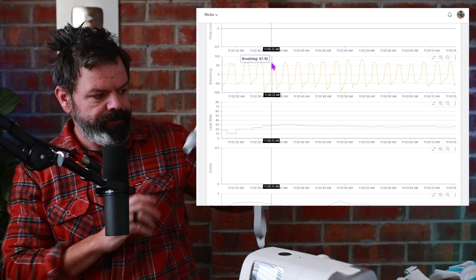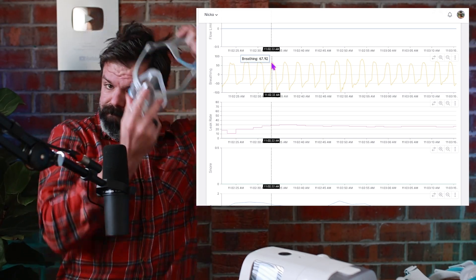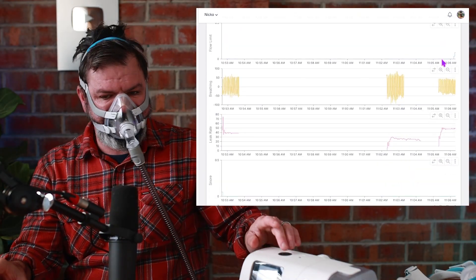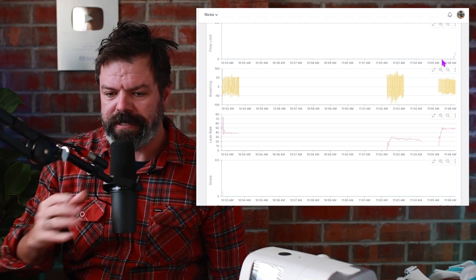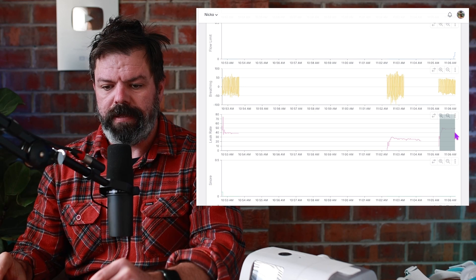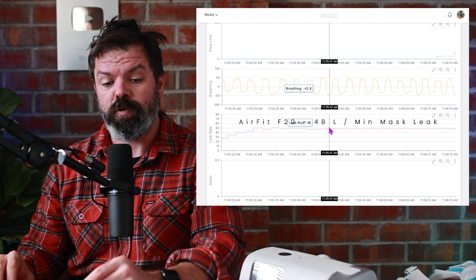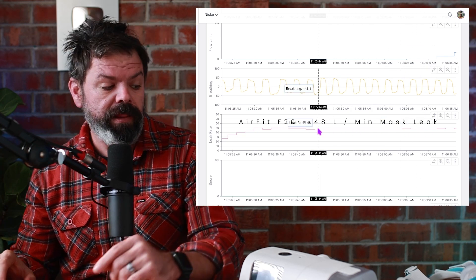We'll go with the F20. I would expect this mask to seal better. So now we have the F20 data — look at that. I had that really tight, but it's up here at 48 litres per minute, much higher. Let's try another mask.